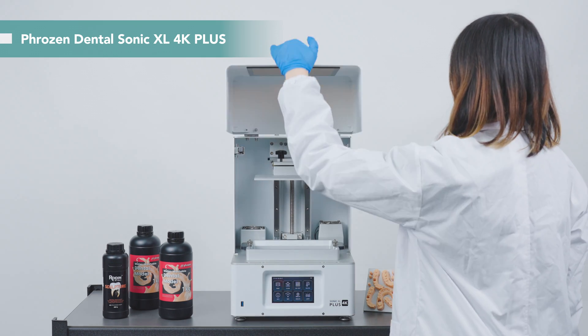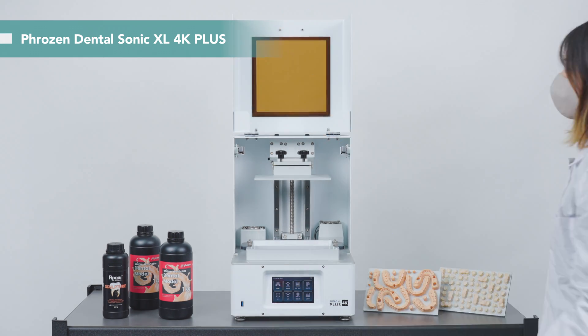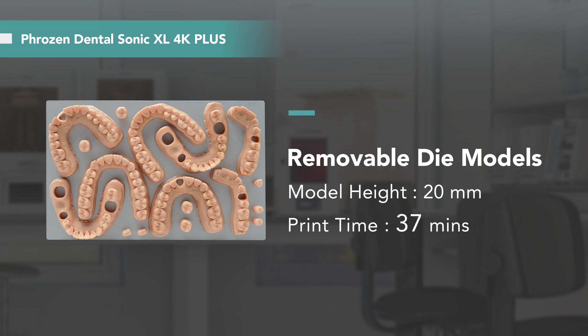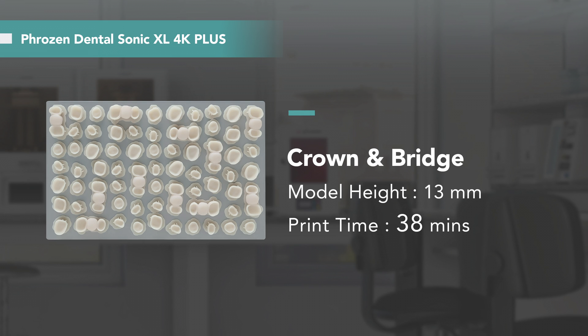This is the Frozen Dental Sonic XL 4K Plus. To improve the dental 3D printing process, it is equipped with a new mainboard system and an improved heater for a more stable printing environment. With a larger building plate, we can print up to 6 to 12 working models at a time, or up to 50 to 150 parts when producing crowns and bridges.